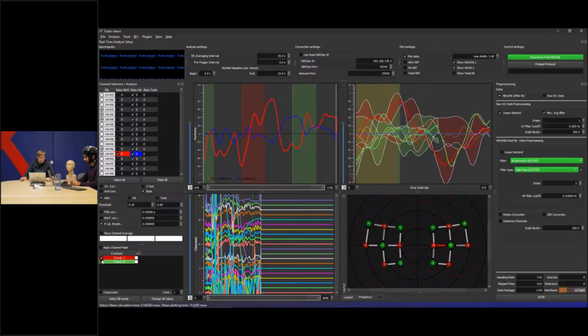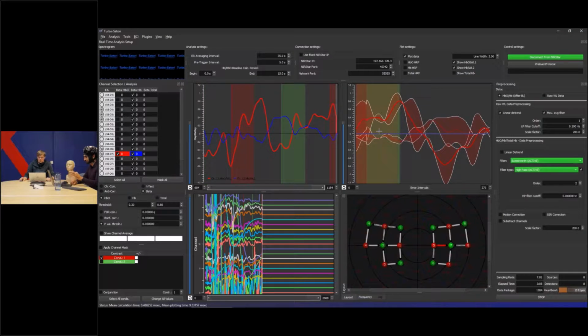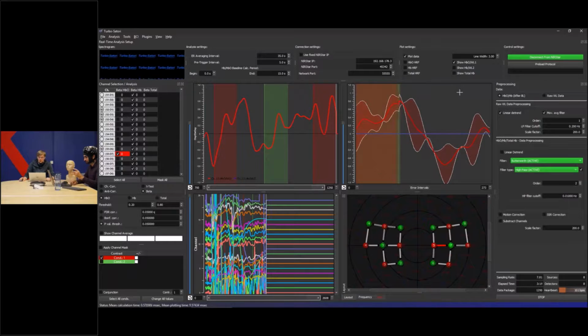Now, after some trials, you can see already a cleaner pattern for the event-related averages, and you can decide which one you want to look at. We can already see that there seems to be a clear time when he starts the task and when he's trying to stop the task.